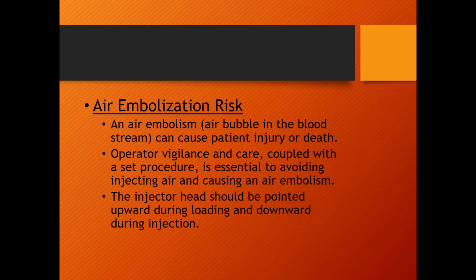When you say people don't use it, do you mean it's a safety system that they turn off, or do you mean it's an actual device? Okay, so it's an external device. Exactly. Different manufacturers have different names for it, but it's basically the same on all of them.